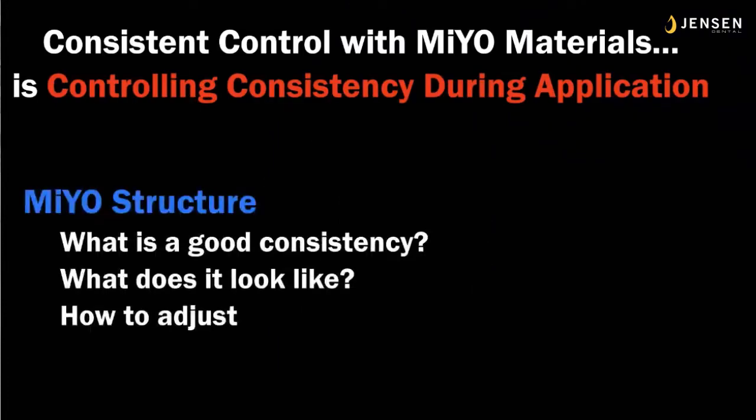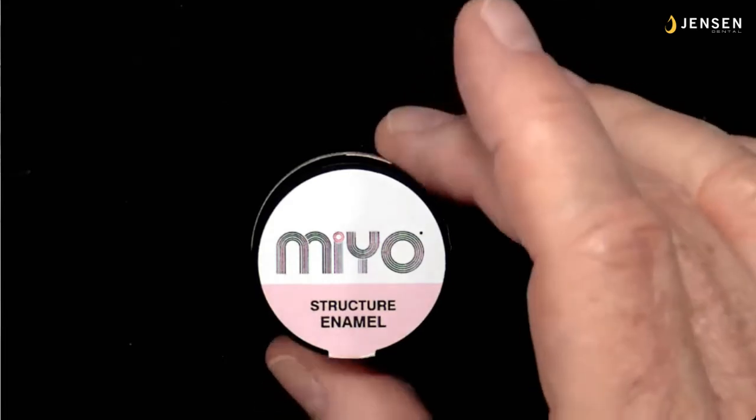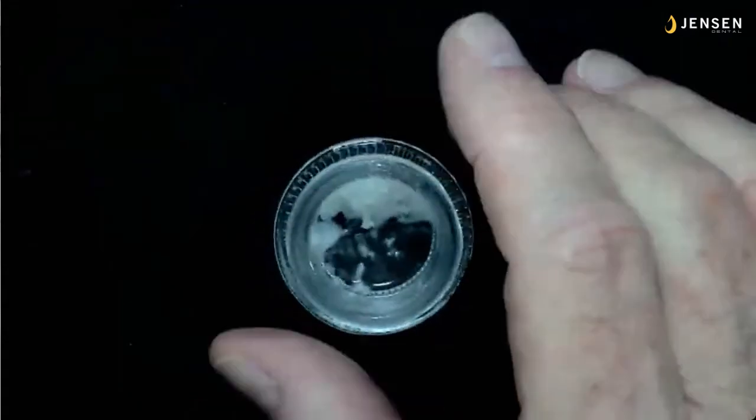So let's talk about controlling the consistency of the MiYO structure. What is good consistency and what does it look like? Well, it's not going to be like the colors. And I'm going to show you how to adjust it. But it's basically kind of like a light cure composite. It's like a porcelain mixed with a glaze liquid and blotted out a little bit. It's got a lot of body to it. It's a little bit on the stiff side. And we don't want to mix this to a honey type consistency. We want this to stay very, very stiff.